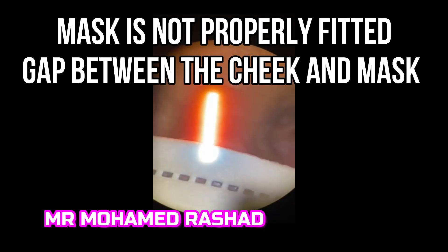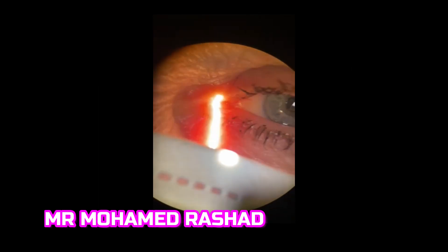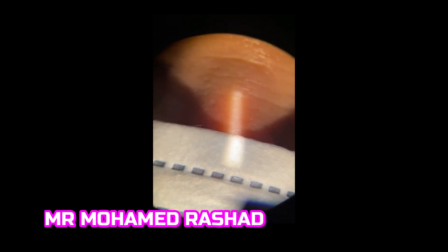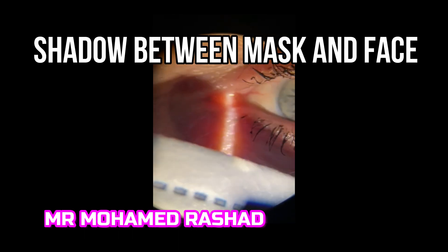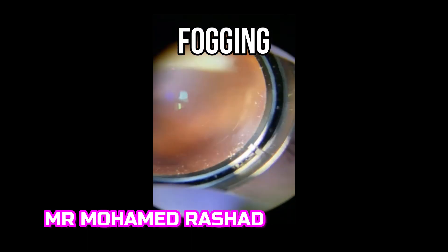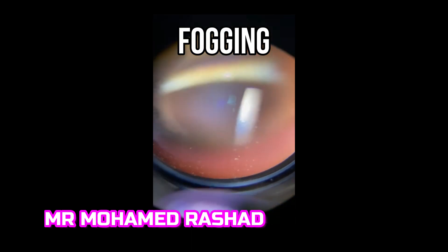This is a very common problem during examination of patients that are wearing masks. You can see now the gap between the mask and the face and the fogging of the lens during examination.